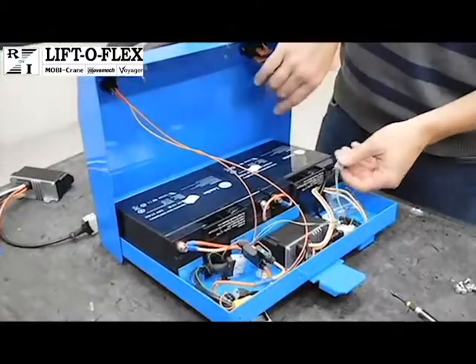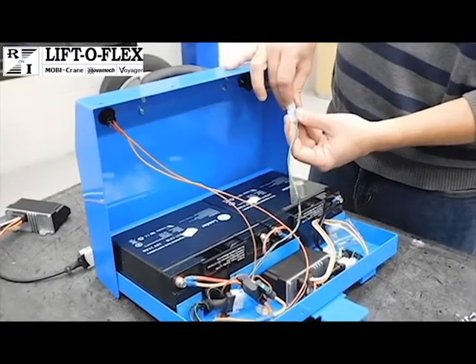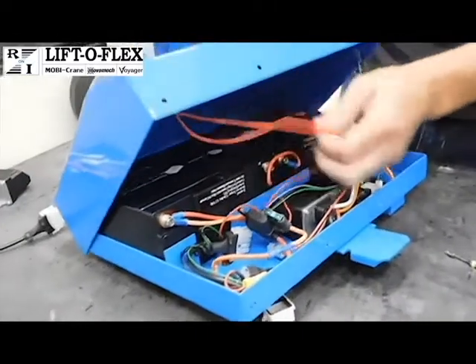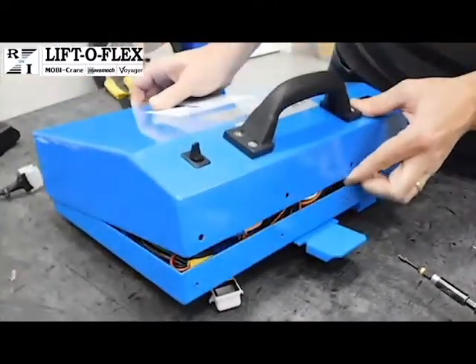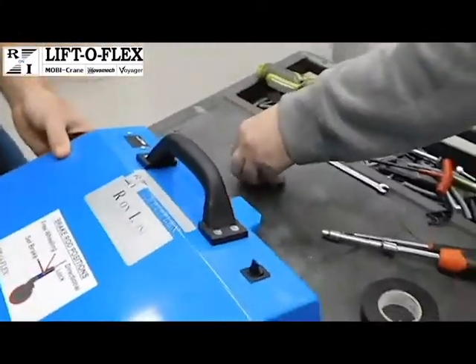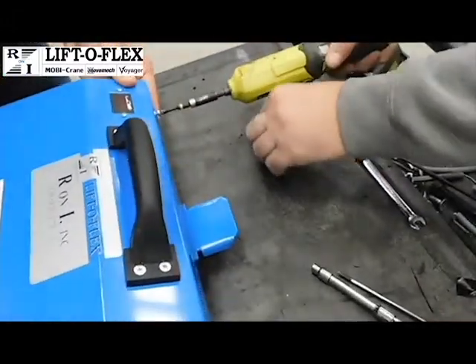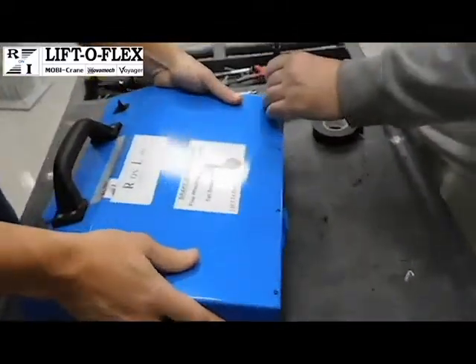The best is to put it on its back. Again, connect the battery meter indicator. This is a one-way connection as well. And then the most important thing when putting the cover on is that you avoid pinching any of the wires between the cover. So just make sure they're all down. Slide it over, and then you'll have the 8 screws to replace. 4 on top, 4 across there, and then there's 4 on the bottom.